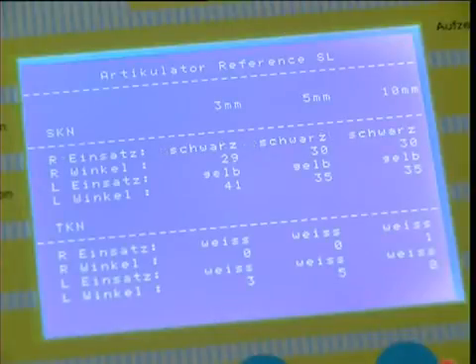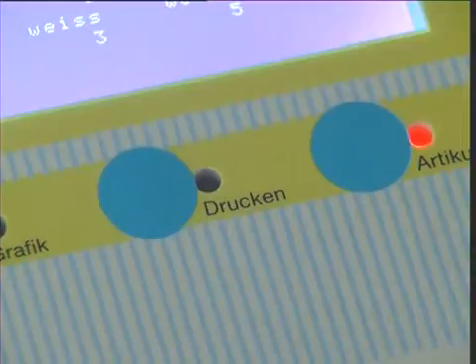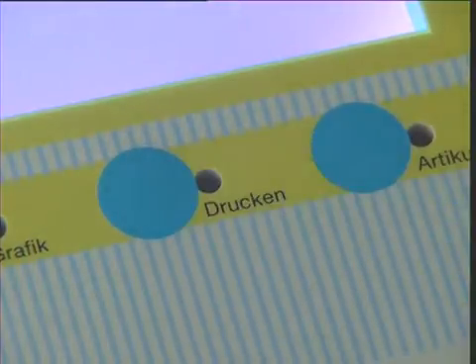This triggers off the calculation process. They are then displayed on the monitor depending on their complexity. The time required depends on the processor performance. Press the print key to print the registration and adjustment data for forwarding and filing.